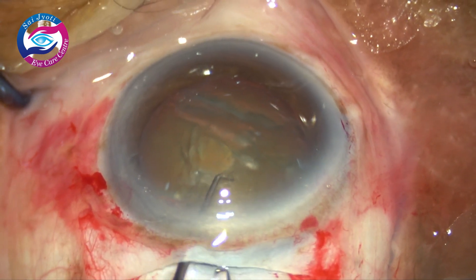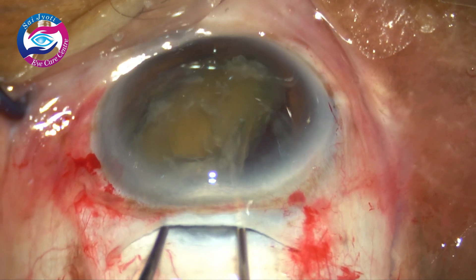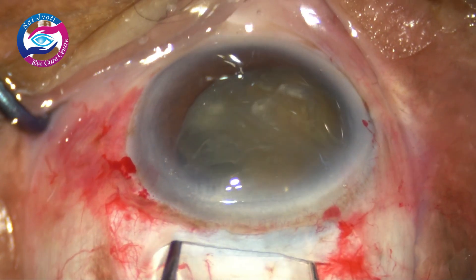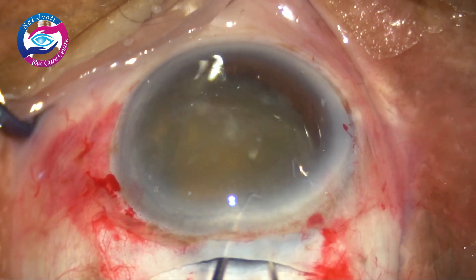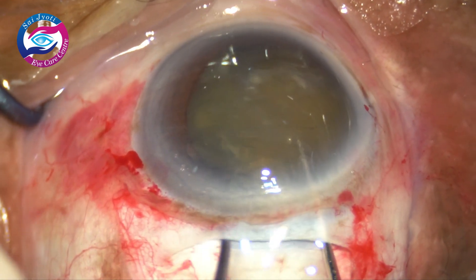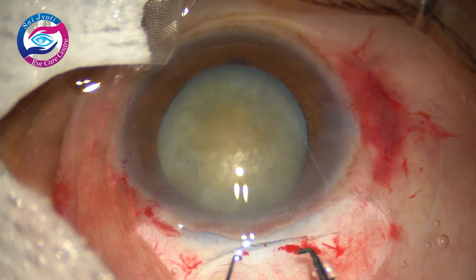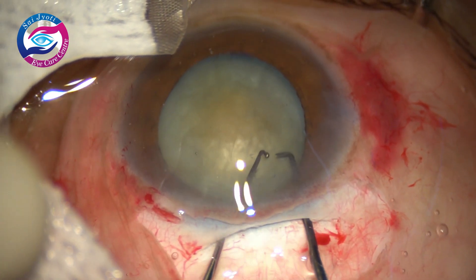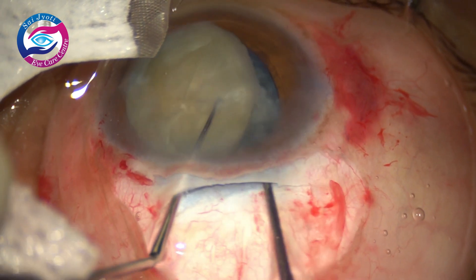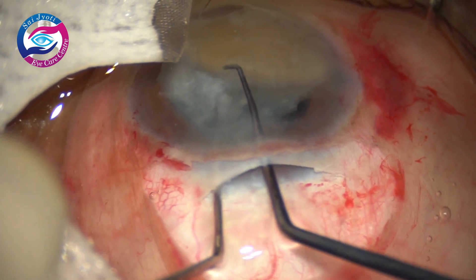Now I am going to demonstrate how to prolapse the nucleus out of the bag using two Sinski hooks. One Sinski is used to just push the nucleus slightly downwards and the other Sinski hooks the equator, and then the nucleus is wheeled out of the capsular bag. It is a very good technique which can be employed very easily in cases with zonular weakness and even in small pupils, because when you have two instruments the iris can be easily maneuvered. Again, one Sinski pushes the nucleus slightly downwards and the other Sinski hooks the equator, and with the help of both the Sinski hooks one can easily wheel out the nucleus.